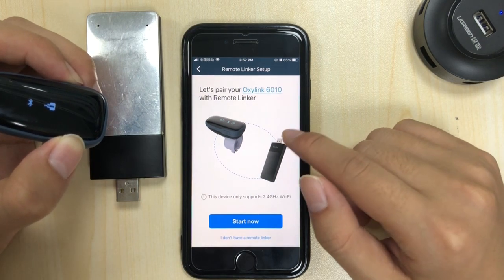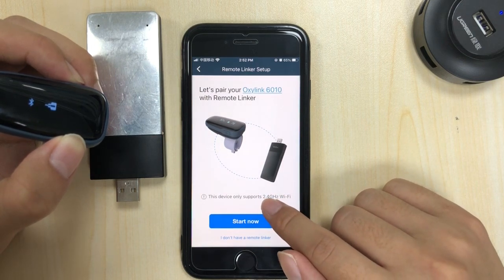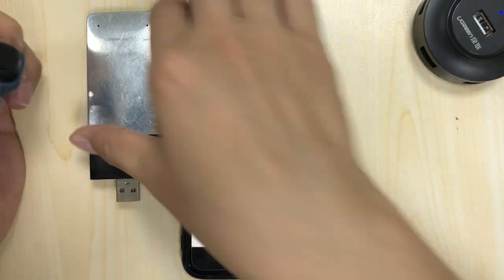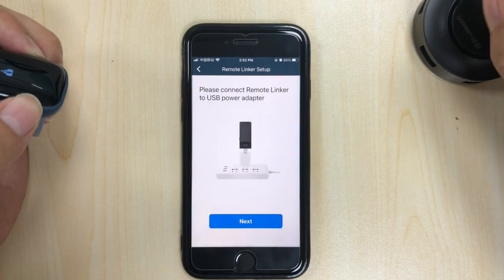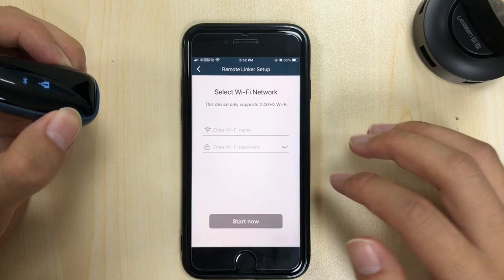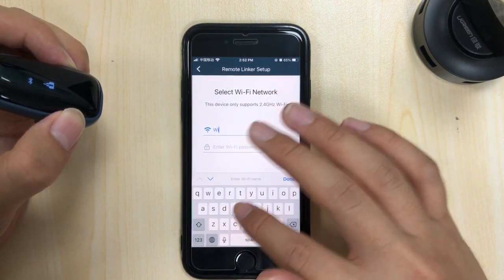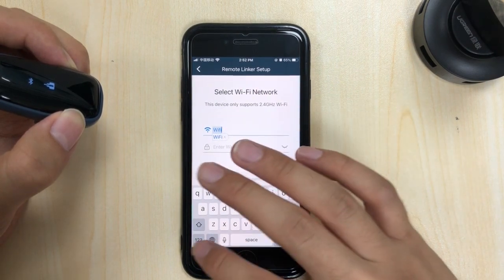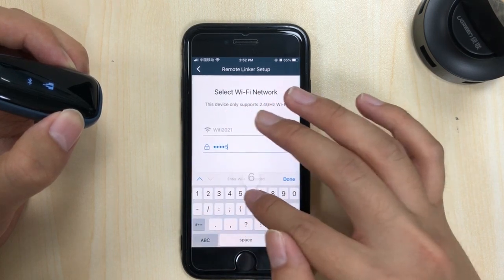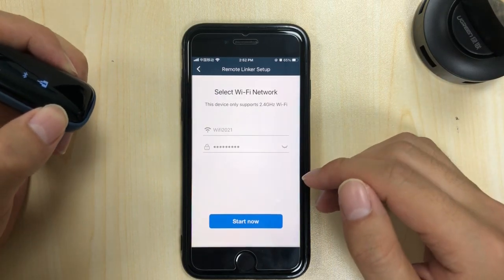Make sure you use the correct Wi-Fi type shown here, then tap start and plug it in to power. Next, enter your Wi-Fi name and your password.